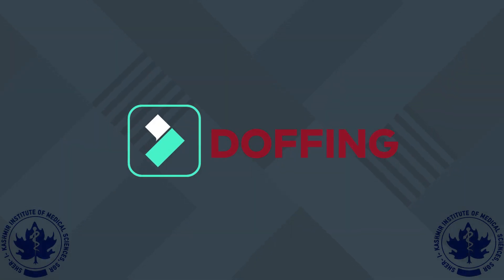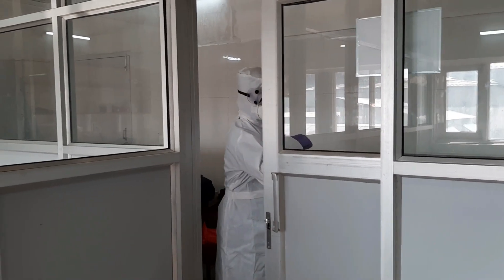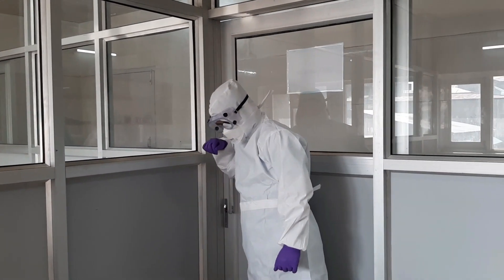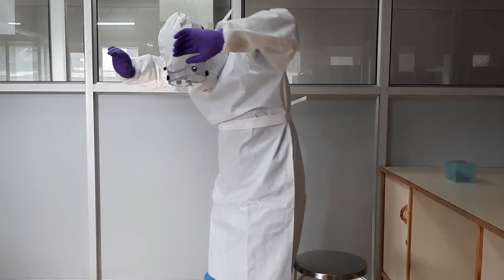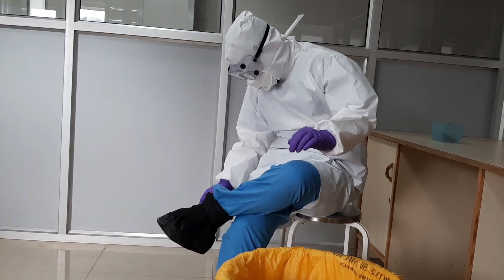We are now demonstrating the necessary steps for doffing PPE. Before doffing, ensure that your PPE is discarded in a proper color-coded bag as recommended per the guidelines of hospital waste management. To begin doffing, remove your disposable boots and shoe covers.